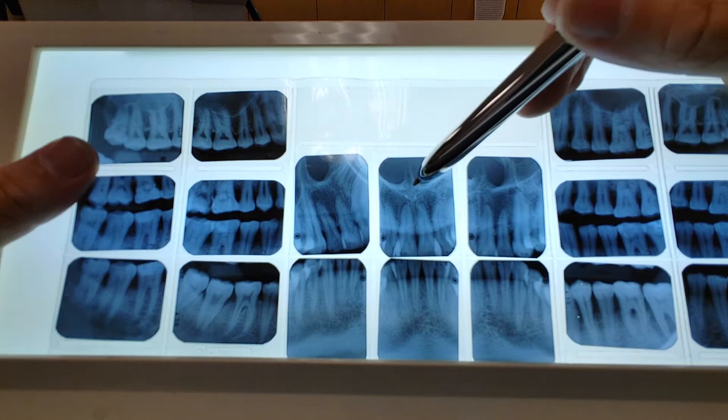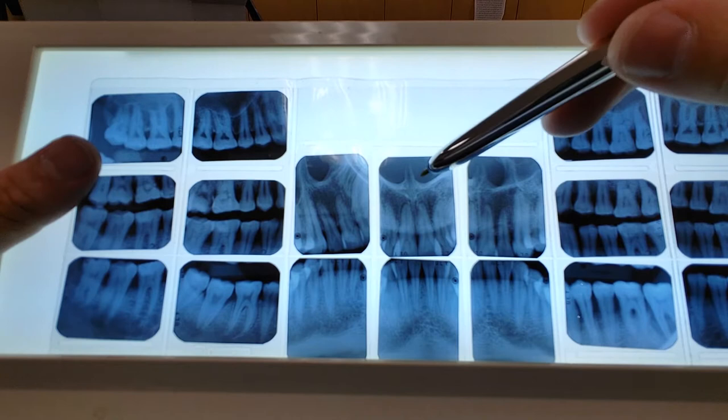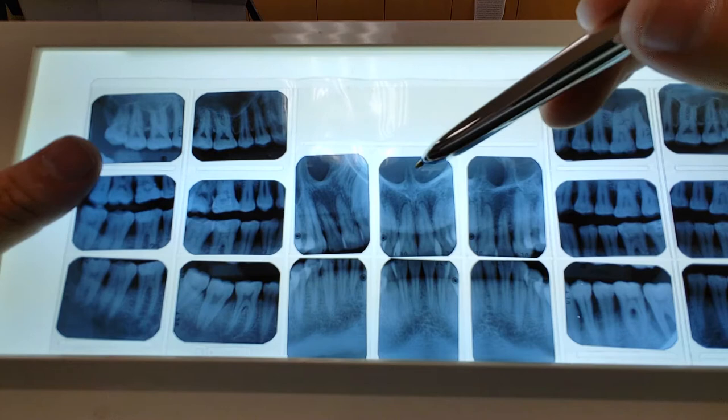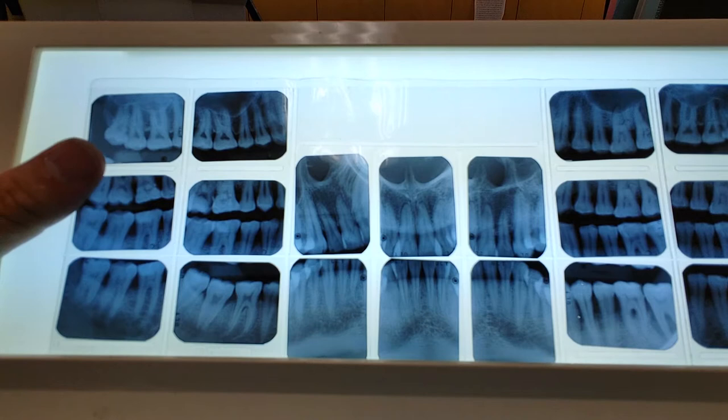If you see the nasal septum or nasal cavity appearing in these front areas, it means you probably had too much angulation, bringing an area that's not needed down into the shot instead of capturing the crowns of the teeth. But importantly, if we ever see this nasal septum or nasal cavity in the front areas, we know these are going to be the maxillary — the top front teeth. That's one key landmark to look for.